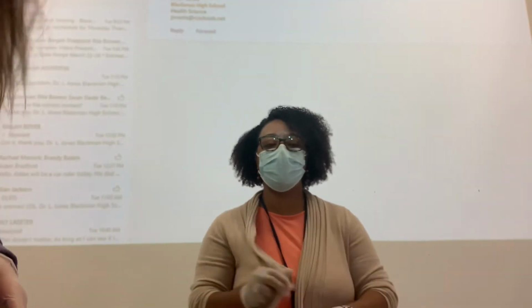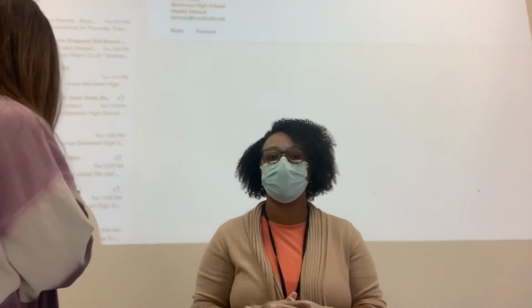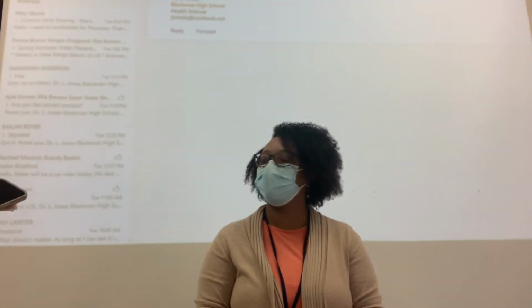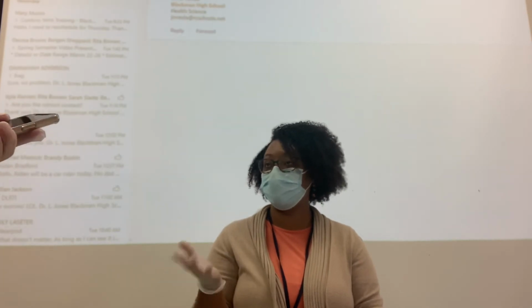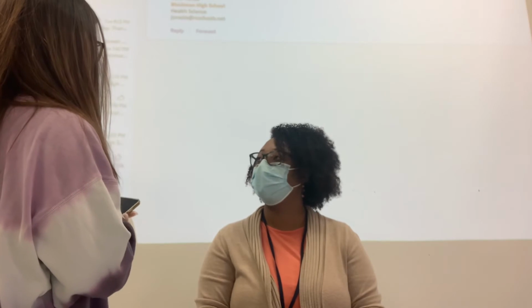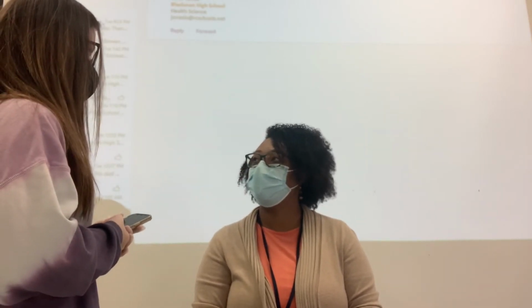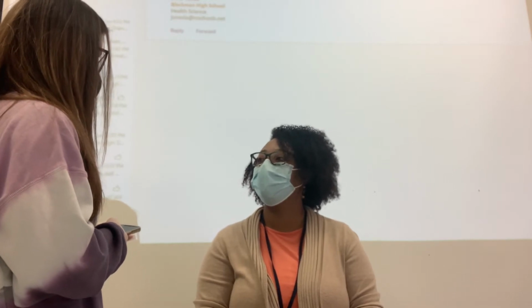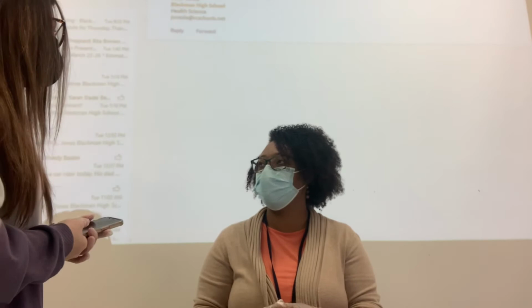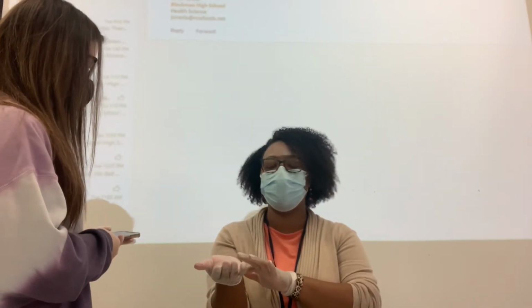All right, so make sure you introduce yourself and you tell me what you're getting ready to do. You're getting ready to do my vitals, right? So tell me your name. Okay, and what are you here to do? All right, and you asked me my name. All right, Dr. Jones. And then I have a wristband on, which we're pretending.